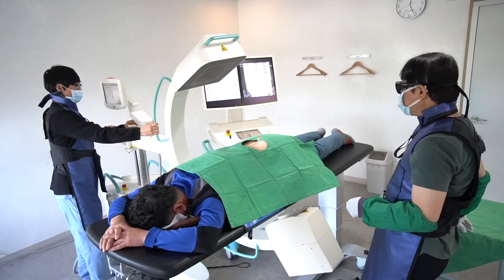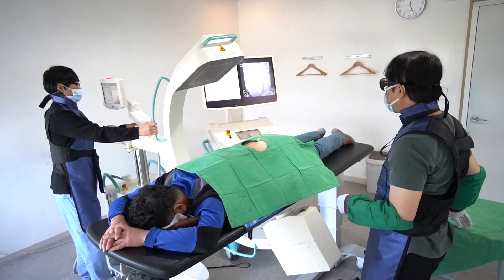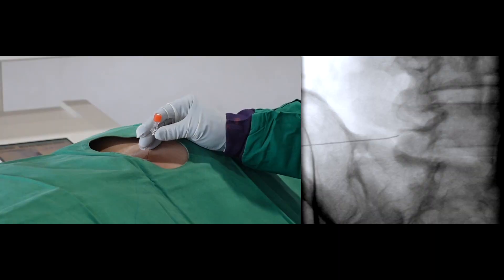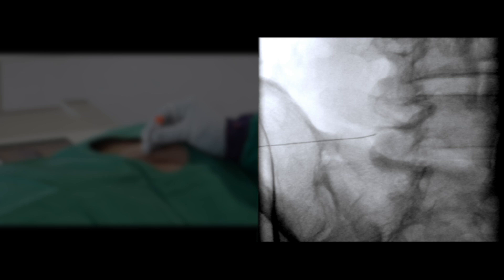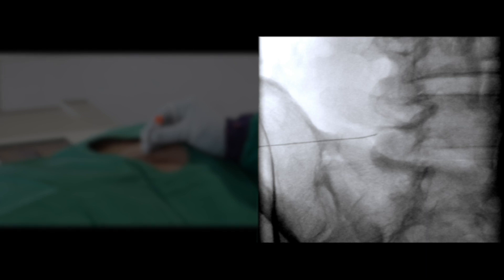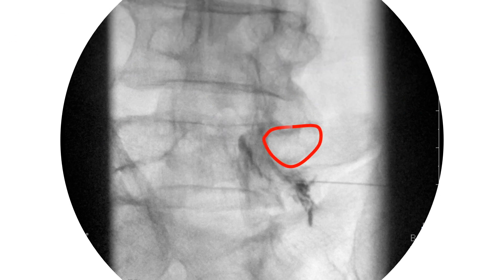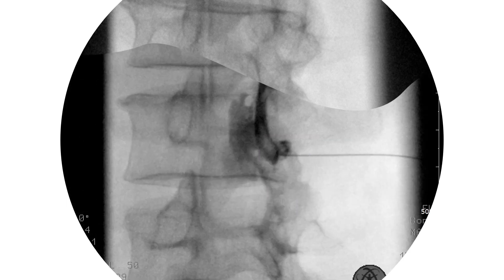I will turn the C-arm to Contralateral Oblique position for double confirmation. I rotate the C-arm as much as possible until I can see the clear profile of the cut section of the pedicle. Please remind the location of the pedicle and pathway of the nerve block in the left Contralateral Oblique image.